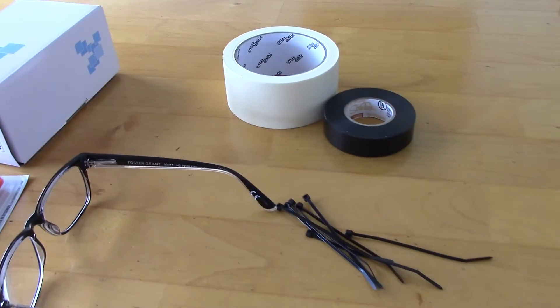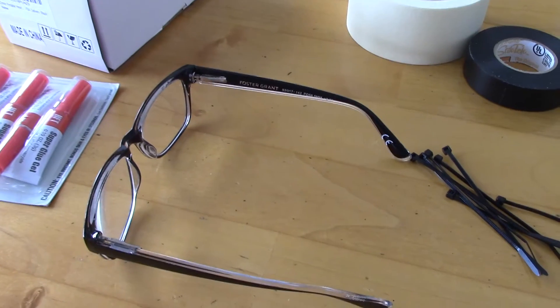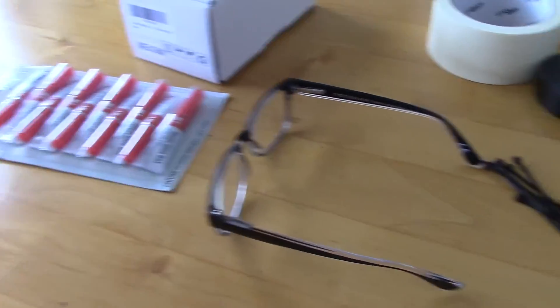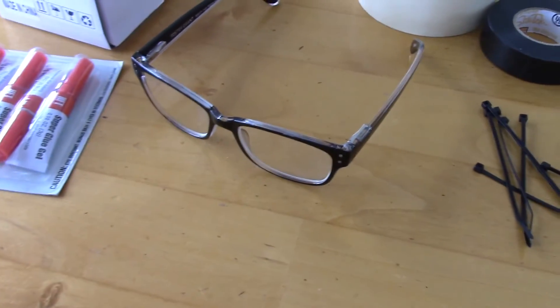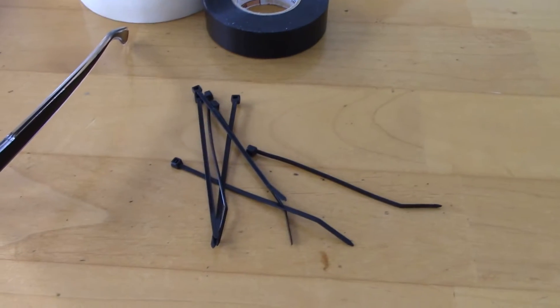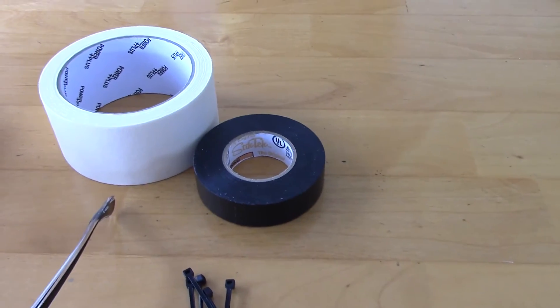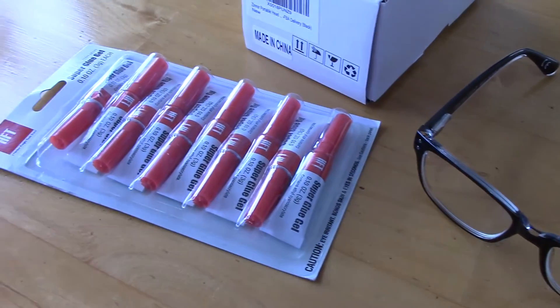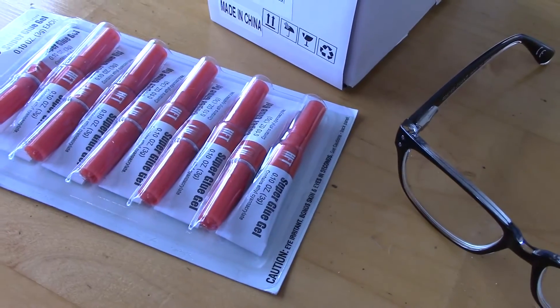The equipment that you need is your glasses — just spare glasses or your reading glasses, whichever you like. This is just a Foster Grant reading glass I got from a drugstore. And you need some zip ties — 4-inch black zip ties — electrical tape, masking tape, and some superglue. I get these superglue gels from Harbor Freight Tools.